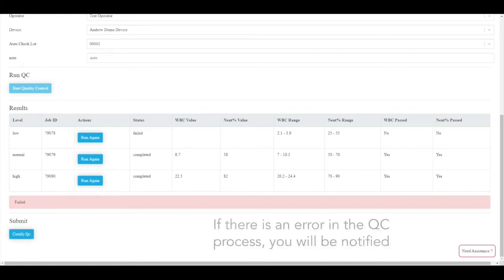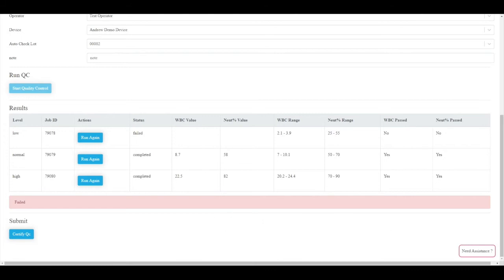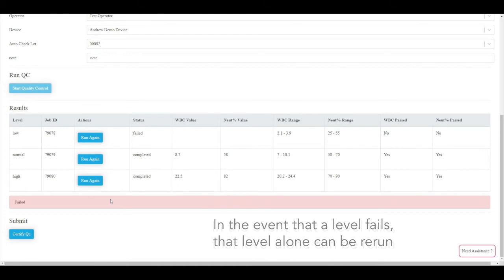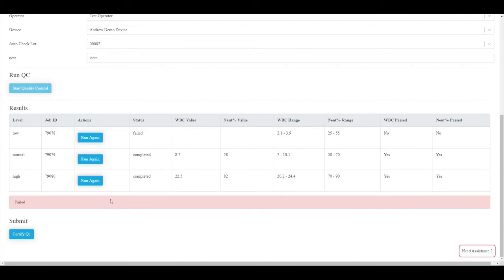If there is an error in the QC process, you will be notified. In the event that a level fails, that level can be rerun without restarting the entire QC process. Click Run again.